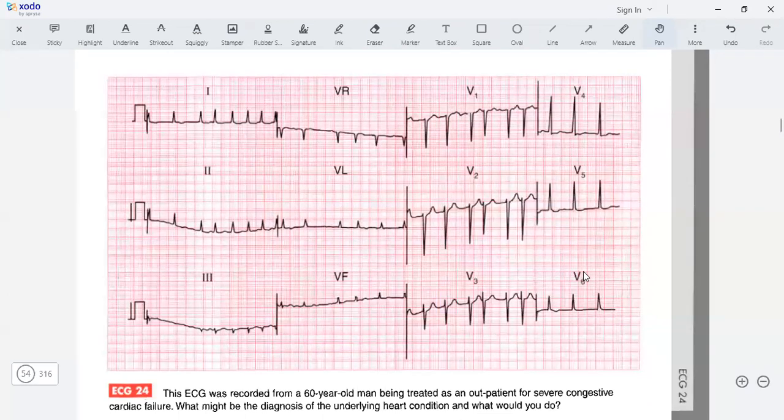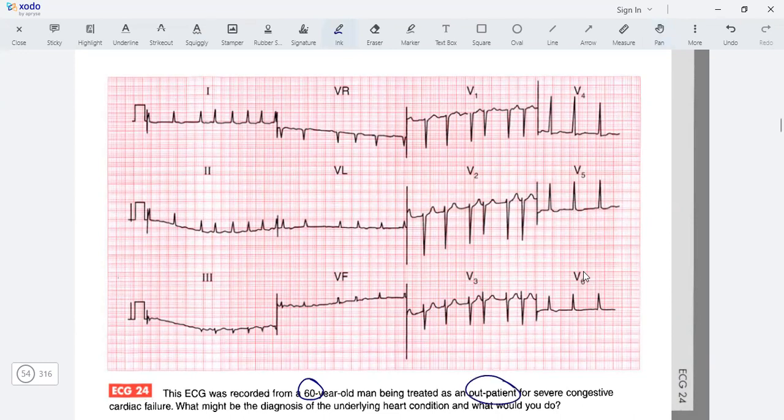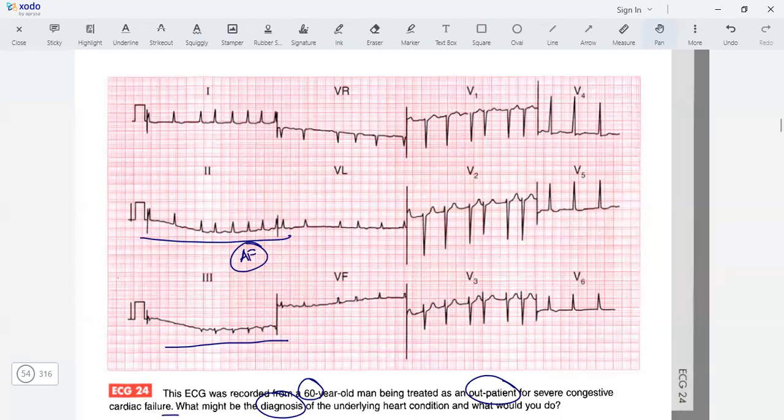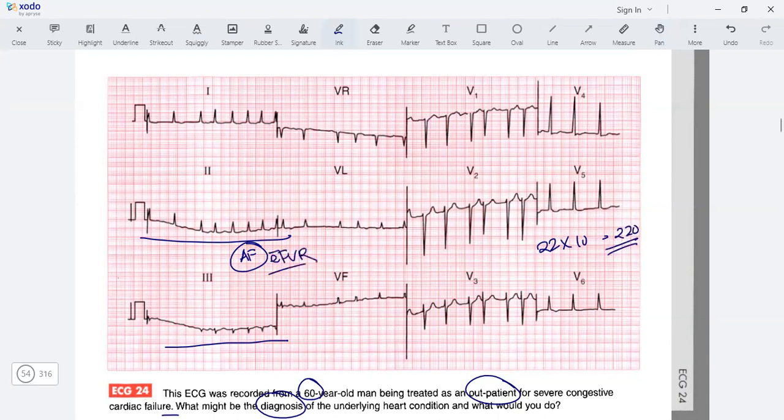Moving to another ECG: a 60-year-old man with severe congestive heart failure. The rhythm is irregular. This is AF - the baseline is not showing a definite P wave, so this is more of an AF rhythm. The rate is high. Counting from here: 1, 2, 3, 4, 5, 6, 7, 8, 9, 10, 11, 12, 13, 14, 15, 16, 17, 18, 19, 20, 21, 22 - that's 220. The rate is around 220, so AF with a fast ventricular rate.